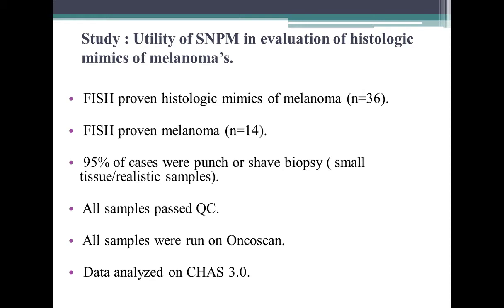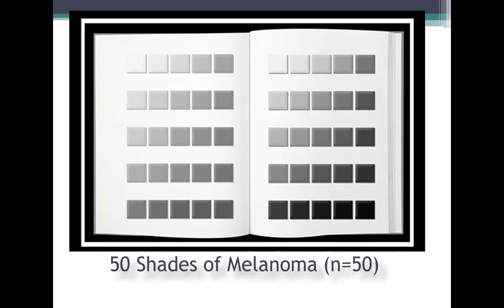All the samples in our study passed initial QC. All the samples were run on the OncoScan FFPE assay, and the data was analyzed on the CHAS 3.0 analysis software provided by the manufacturer.